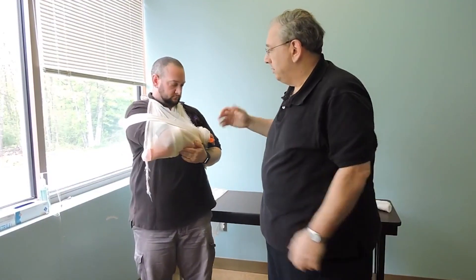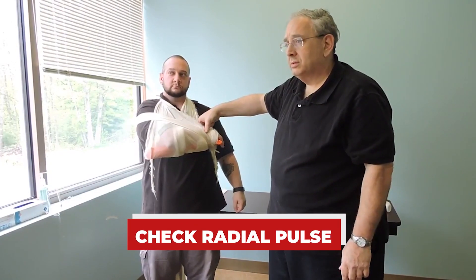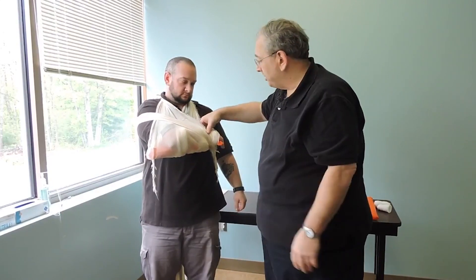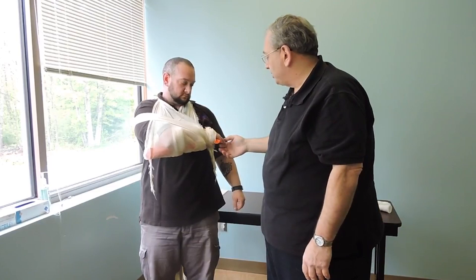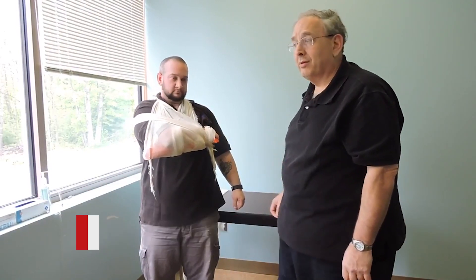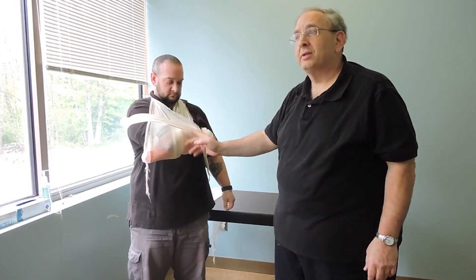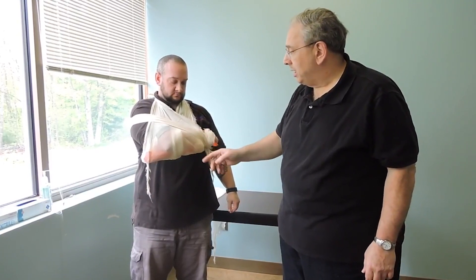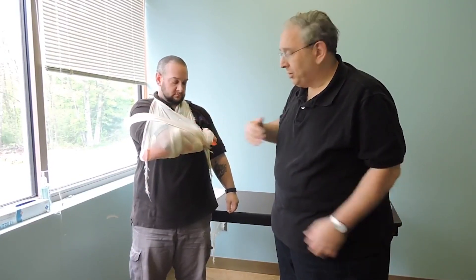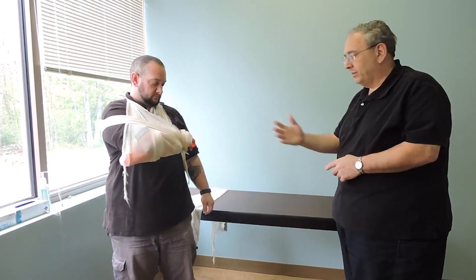My arm is secure. I'm going to check for a radial pulse to make sure I didn't tighten this so much that I occluded the pulse. I'm going to check for CSMs — can you feel me touching? I do. I'm going to check for capillary refill. The object is not to impede circulation — that broken bone should be stabilized above and below, and that swath, while holding the arm in, should not be touching that mid-shaft fracture site.